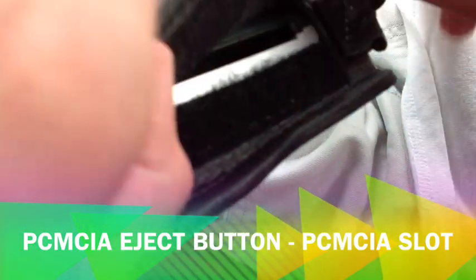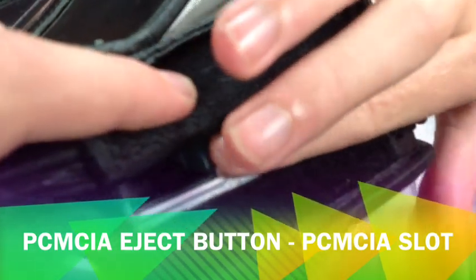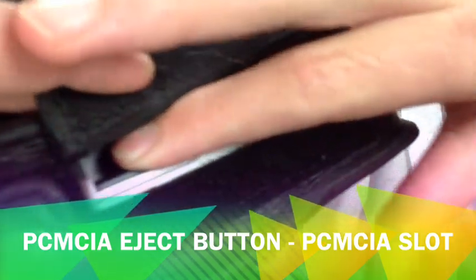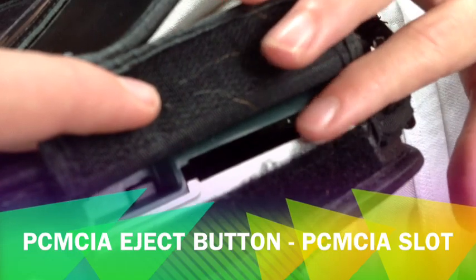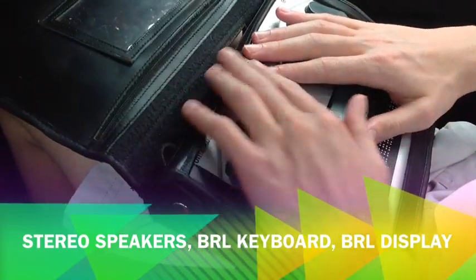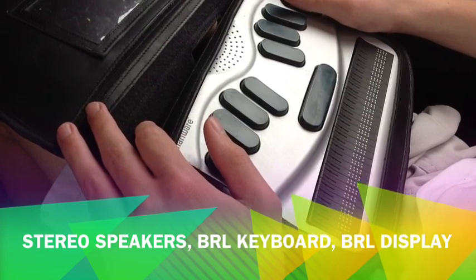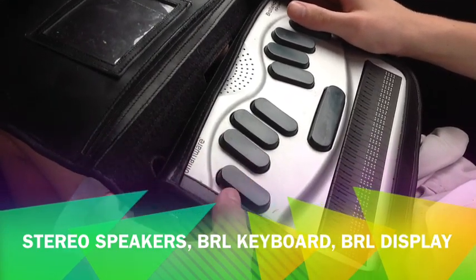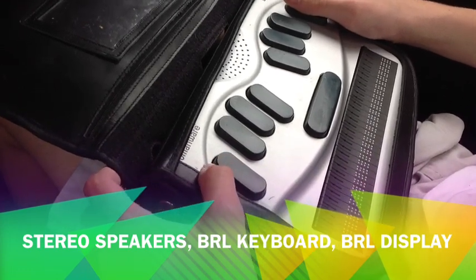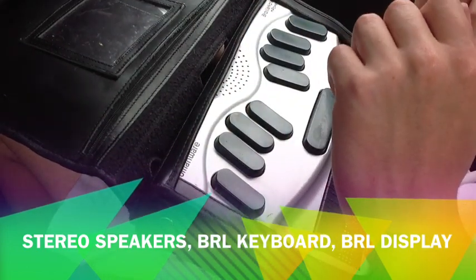On the right side we've got a PCMCIA card slot, which can take adapters for a bunch of different cards, and then the card eject button to eject the PCMCIA card. That's the basic hardware on the sides and back. Looking at the top, you have the Braille keyboard, the speaker, and the Braille display. The Braille display has 32 standard Braille cells — you can get different models with 18 or 32 cells. The Braille keyboard is standard — 6 dots plus a space bar — and on the left and right you have backspace and enter keys, which can change functions slightly based on what you're doing.